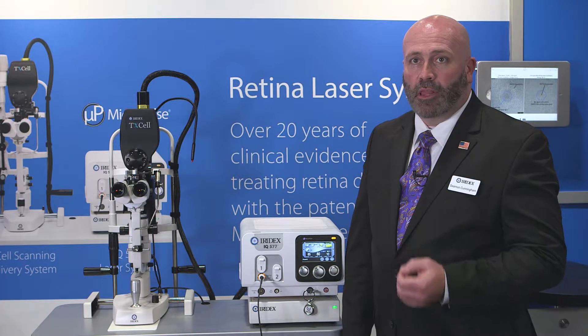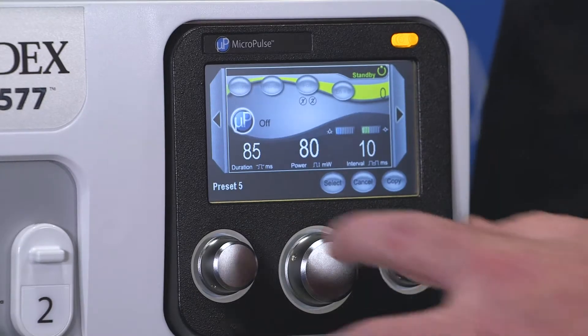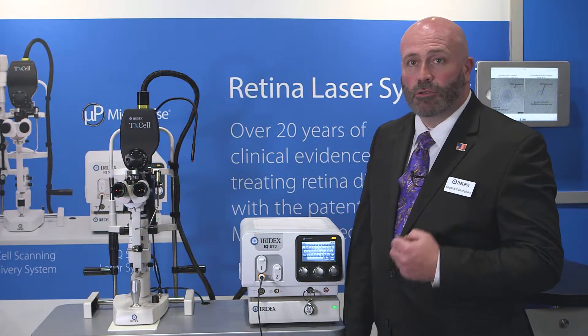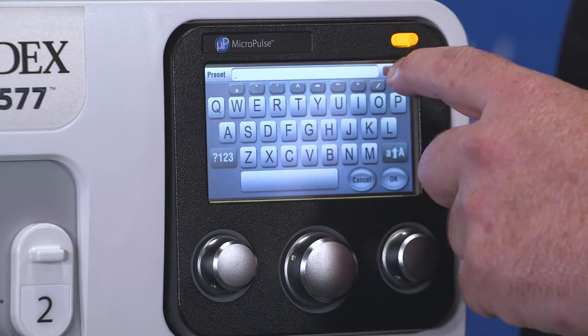This opens the screen where you're allowed to program the preset. To program the preset, first we're going to change the name by pressing the bottom left of the LCD screen. This will bring up a keyboard that will allow you to delete the existing name and type in the new name for the preset.